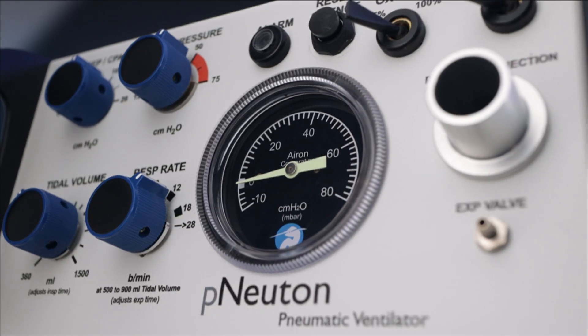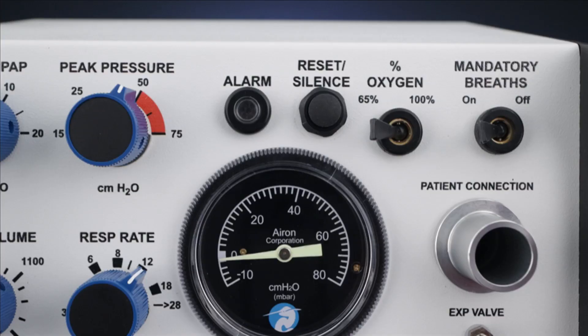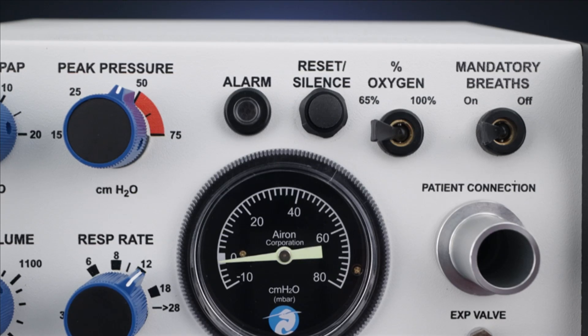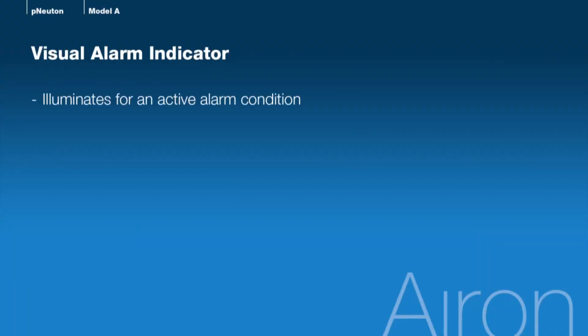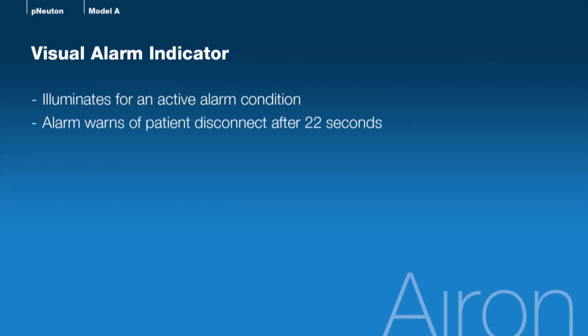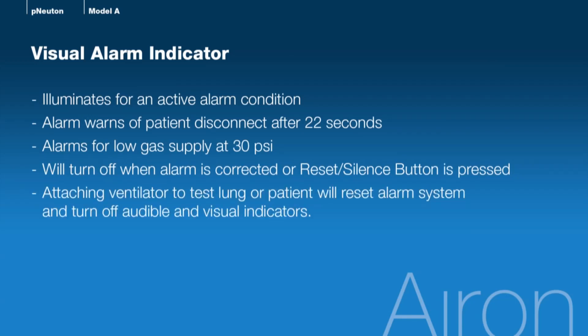Next, let's move to the right-hand side of the front panel to discuss audible and visual alarms. Above the pressure gauge are the Visual Alarm Indicator and the Alarm Reset/Silence buttons. The Visual Alarm Indicator illuminates for an active alarm condition. The alarm warns of a patient circuit disconnect after 22 seconds, or when the gas supply is at less than 30 psi. The alarm will also activate as soon as an oxygen source is turned on to the ventilator. You may silence the alarm for one minute by pressing the Reset/Silence button. Attaching the ventilator to a test lung or the patient and starting ventilation will automatically reset the alarm system and turn off the audible and visual indicators.